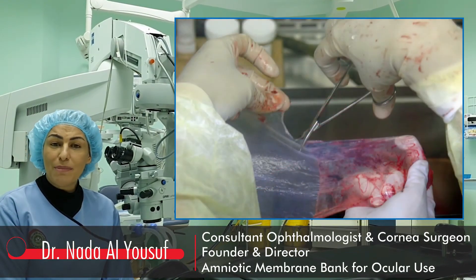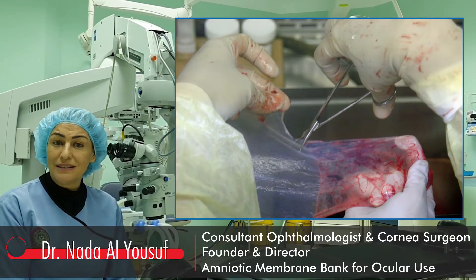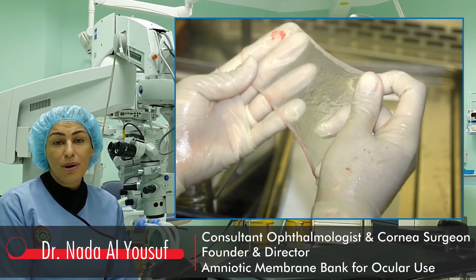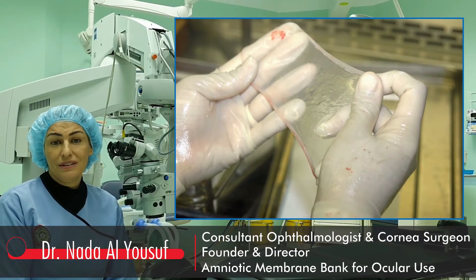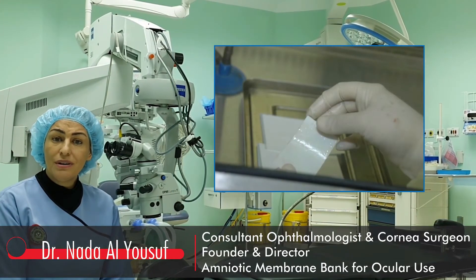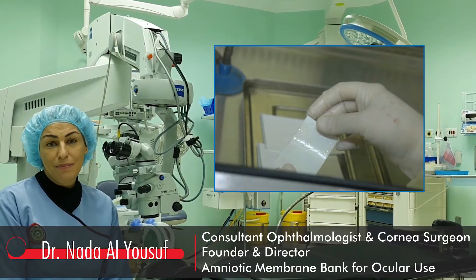The amniotic membrane is cut into 2.2 cm pieces. Each piece is examined for any possible buttonholes. The pieces are then placed onto nitrocellulose paper with the epithelium basement membrane facing up.